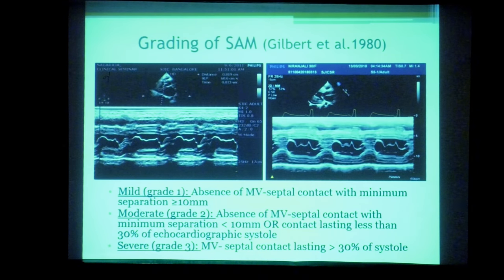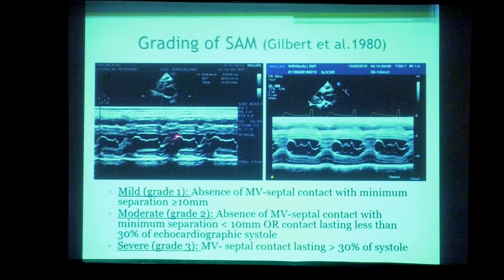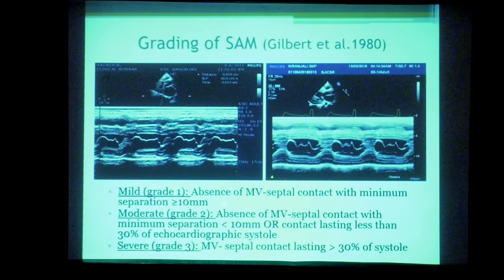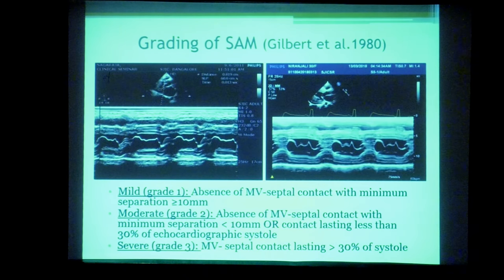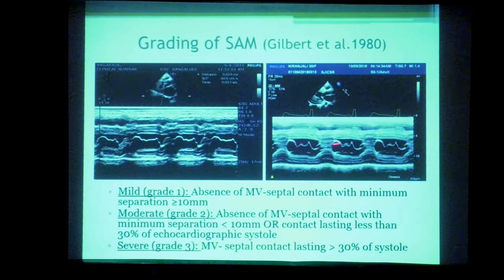SAM has been graded by Gilbert et al. in 1980. If the minimum distance between the mitral valve and septum is more than 10 mm, it is mild SAM. If less than 10 mm or if the septum contact occurs for less than 30% of systole, it is moderate SAM. If the leaflets are touching the septum for most of systole, it is severe SAM.